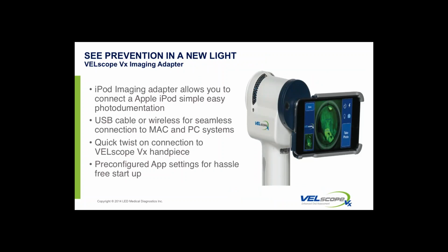And what's cool about it is there's an app where you can take pictures and store pictures. You can review, you can compare, and most importantly, you can email these to yourselves, download them into your charts, or email them to the surgeon for review. Critical. I would tell you this is critical in the process of not only documentation and management, but appropriate care for the patient, especially if it requires a referral.